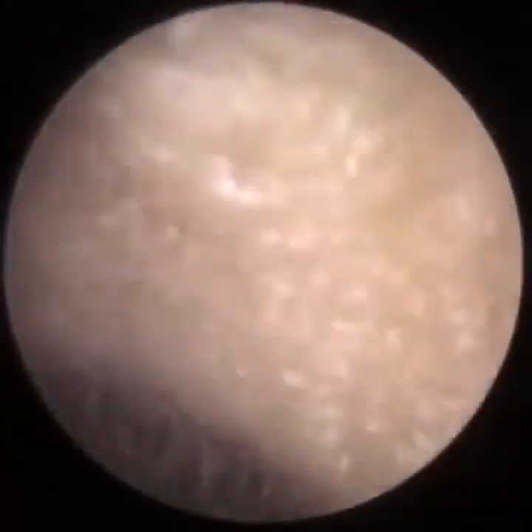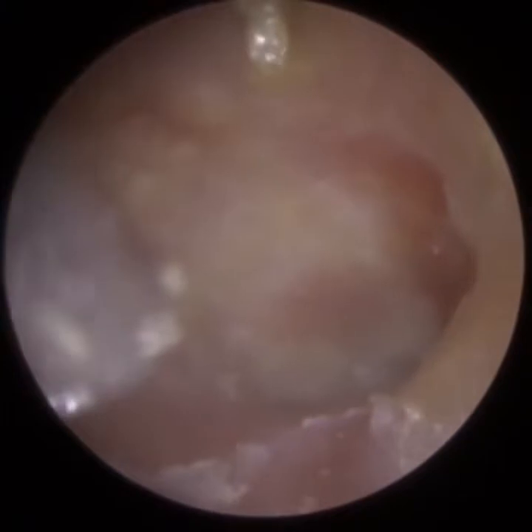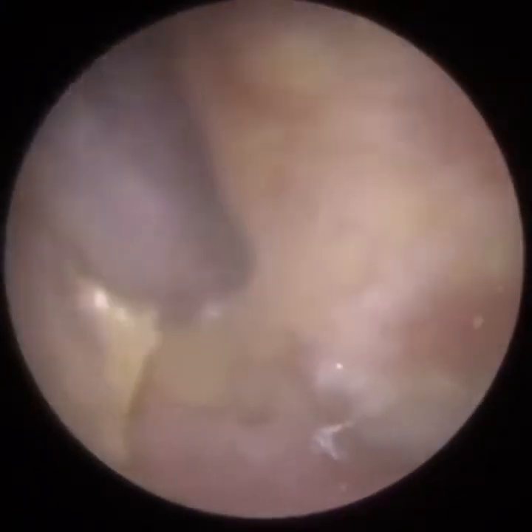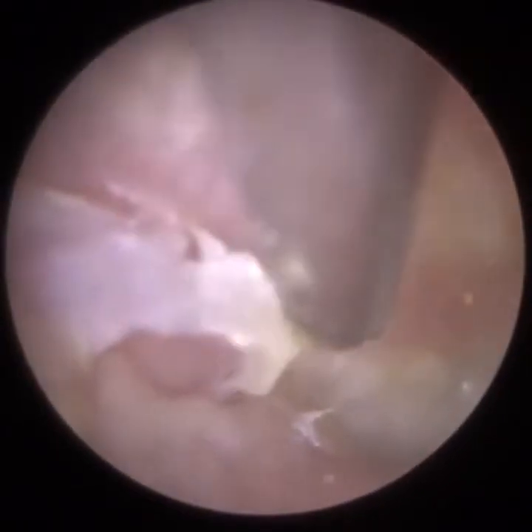So again, just going to mop up near the entrance, just some more keratin there, dead skin. It's a bit stickier. On several occasions, my fine end got blocked, so I had to unblock it. I think I used 2 or 3 fine ends in total, because on a couple of occasions it just got so blocked that I had to discard it and get another one. So again, this damp layer of dead skin. It's like an onion. It's going to peel away.